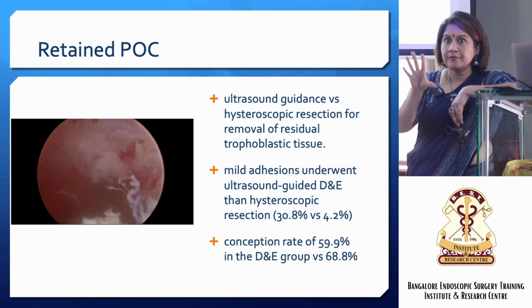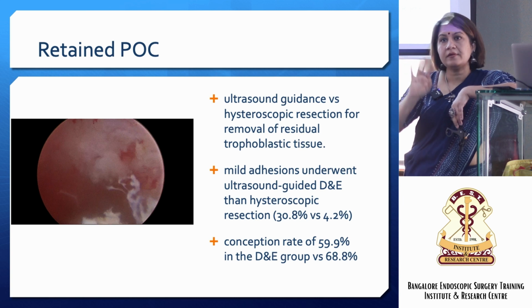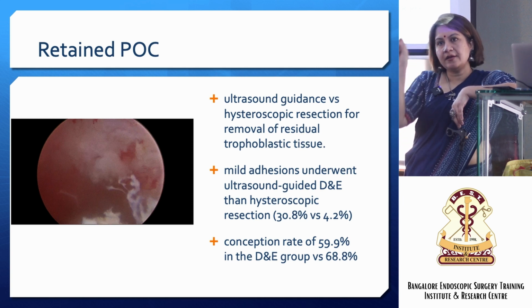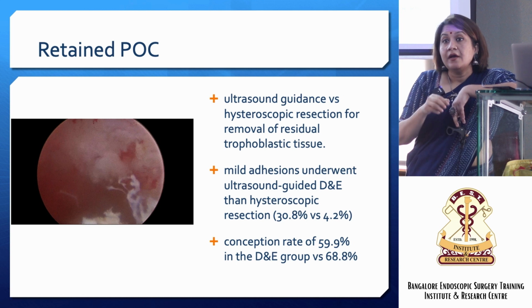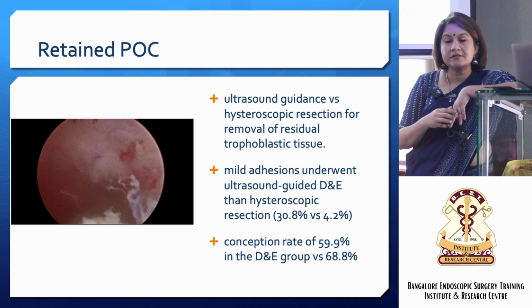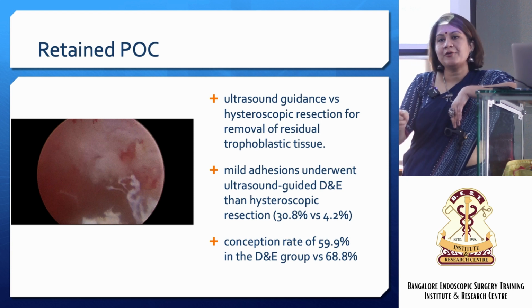Yeah. AV malformation can be very nicely seen in the myometrium. In the myometrium you can see it's not a smooth myometrium. You can see the areas of vascularity. The only thing I find is sometimes the radiologist reports increased vascularity, query AV malformation, query gestational trophoblastic, but it's not difficult. If you do the scan yourself, you can make out a normal myometrium and the retained.